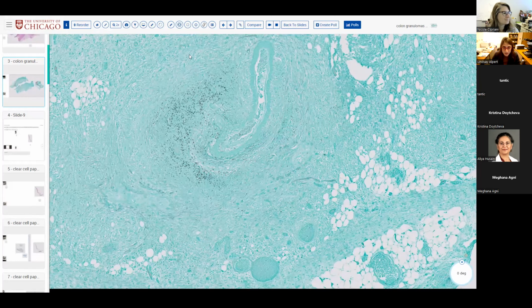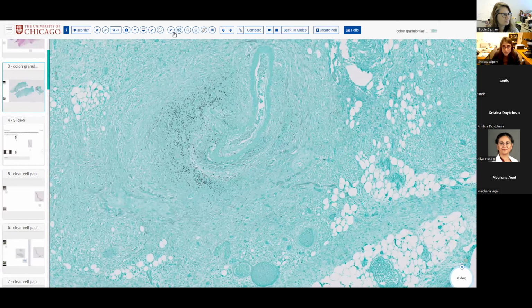That must be really rare to have histo in the colon. I don't know that I've ever heard of it. I have seen histo in the colon before, but it was in an AIDS patient. So in the immunosuppressive setting, you can see it, so it really only occurs in immunocompromised patients. As you know, the organisms are usually within histiocytes or within these areas of necrosis. So usually in the mucosal biopsies, you'll see a lot of histiocytes in the lamina propria in patients who have it. And you always want to work that up with bug stains too.